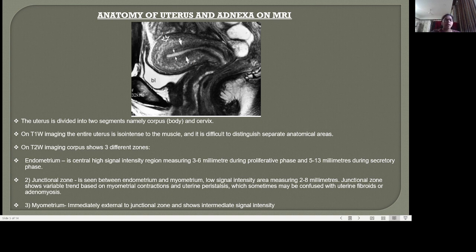The uterus normally lies in a position of anteversion and anteflexion. The body of the uterus is bent forward on the cervix approximately at the level of the internal os, constituting anteflexion. In anteversion, the external os is directed downwards and backwards. When the uterus is retroverted, the cervix is directed downwards and forwards. A sagittal T2-weighted MRI image demonstrates the anatomy of the uterus: zone 1 is the endometrium showing high signal intensity, zone 2 is the junctional zone, and zone 3 is the myometrium with intermediate signal intensity.